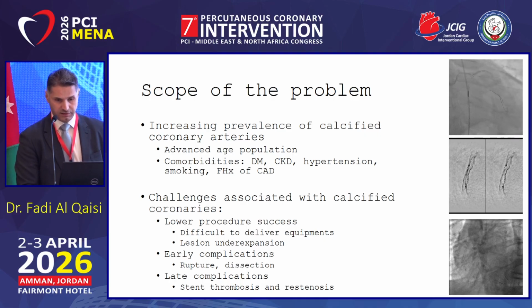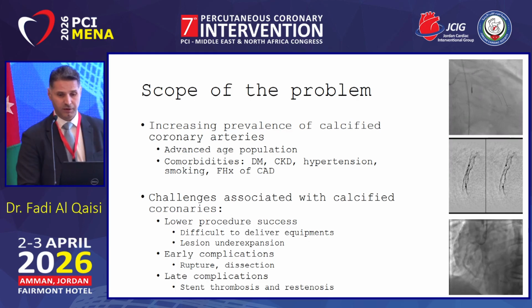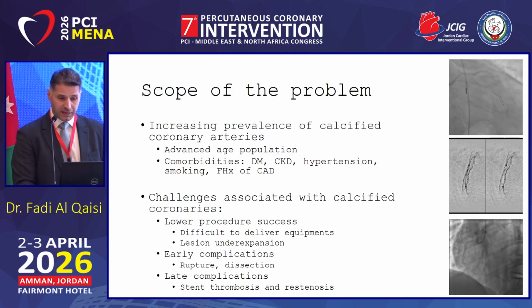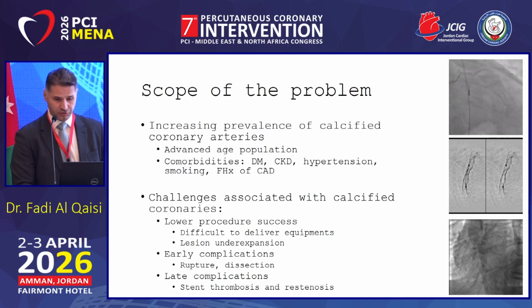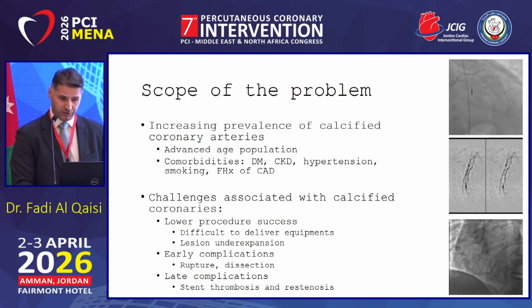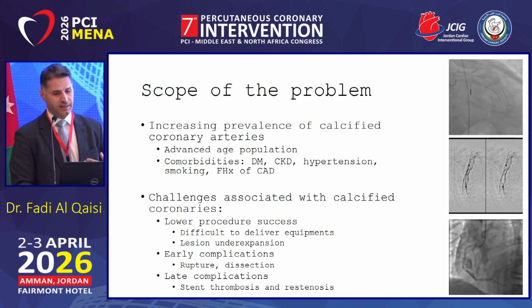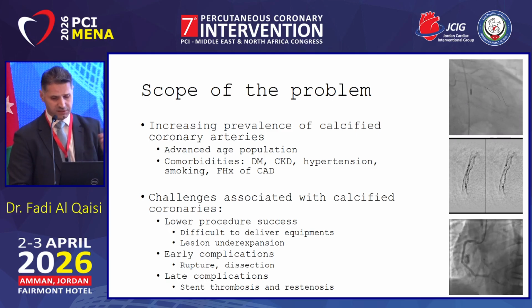As you can see here, this is a stent that was not properly expanded in spite of post-dilatation, and there are multiple complications, such as rupture of the artery and dissection of the artery if you push a little bit too hard. In addition, among the late complications, under-expanded stents in calcified lesions have a higher tendency for stent thrombosis and restenosis.